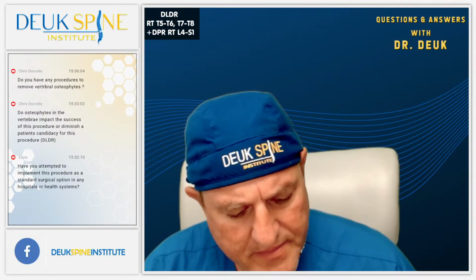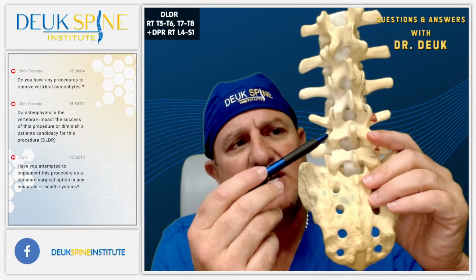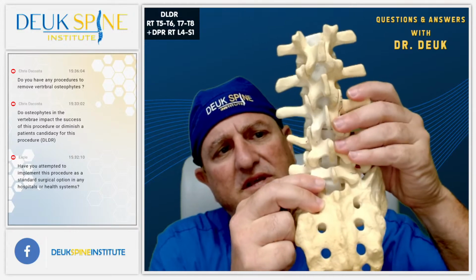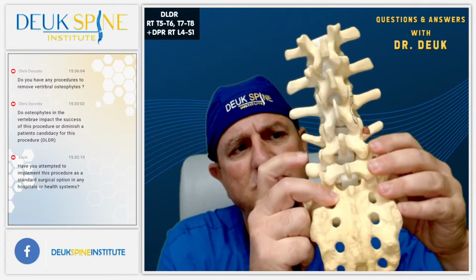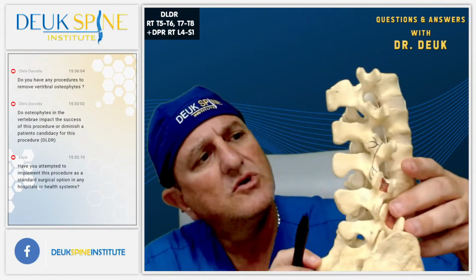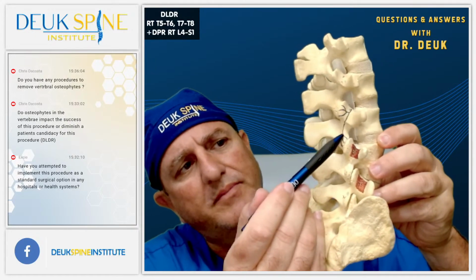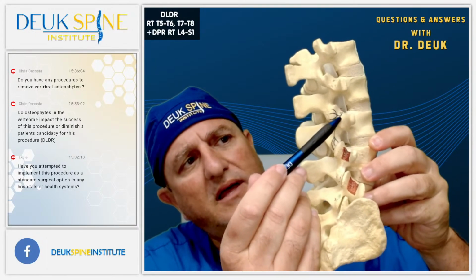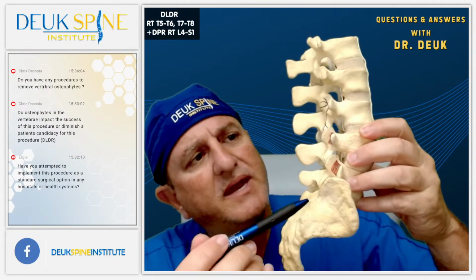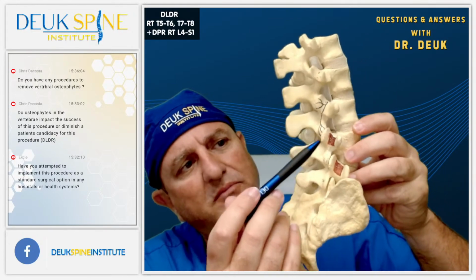Now, people ask me about the Deuk plasma rhizotomy. What are we doing here? Some people have pain in their facet joints. That's a facet joint right there, folks. Watch. See it move? These joints move. And when you injure the joint, you can get pain in the joint. So the nerve to that joint runs right along, right here. It comes out the foramen and runs right along the bone. And if you burn the hell out of that nerve, you deaden it right there, then that joint won't feel pain, and the pain goes away. You got to do it in both places, though. If that's the joint, you got to do it above and below.